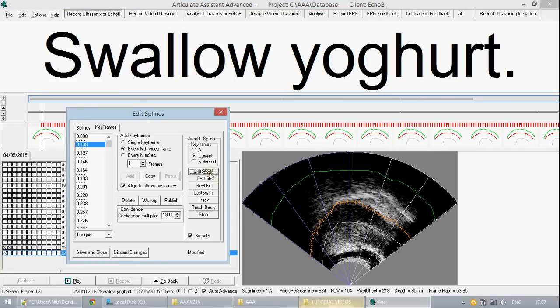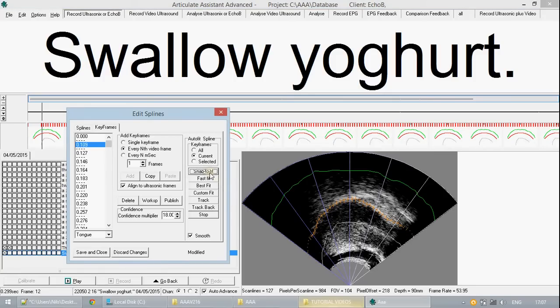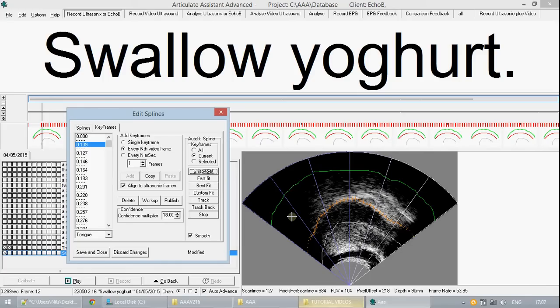What this does is it finds the nearest edge that it can as a place where there is a sudden change between dark and light pixels. This brings me on to an important point to help you fit the best spline to your image.